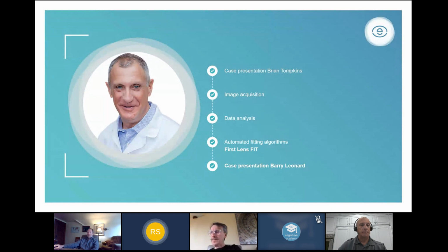Now I will check if there are still some questions unanswered. Art Wong is asking, does the fitter choose the design or does it recommend the best design? No, we're not going to recommend you a certain lab or a certain design. You still have to select whether you are going to work with a Zen lens, the One Fit, or the Boston Sight lens. That's really up to you. We're never going to choose in that way.